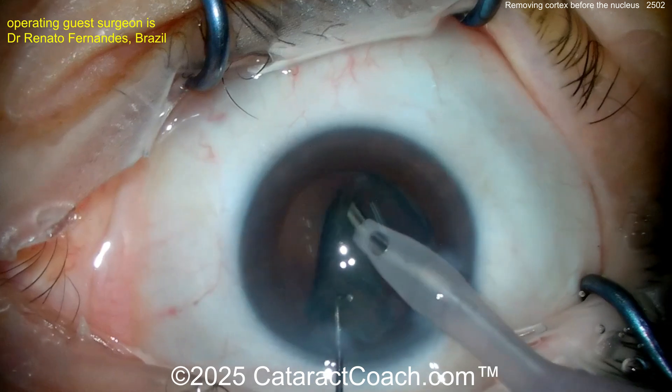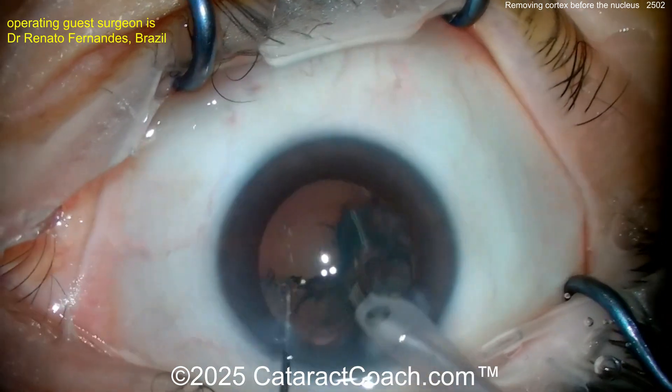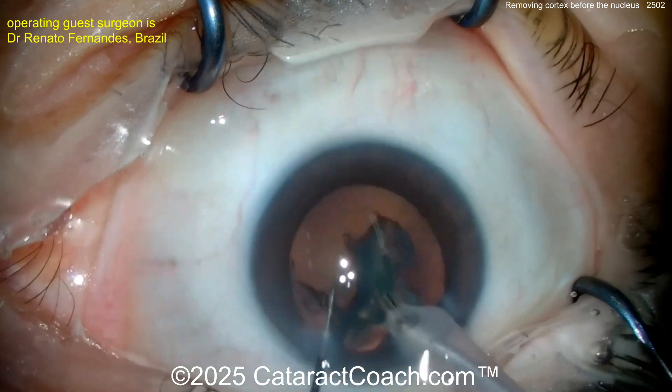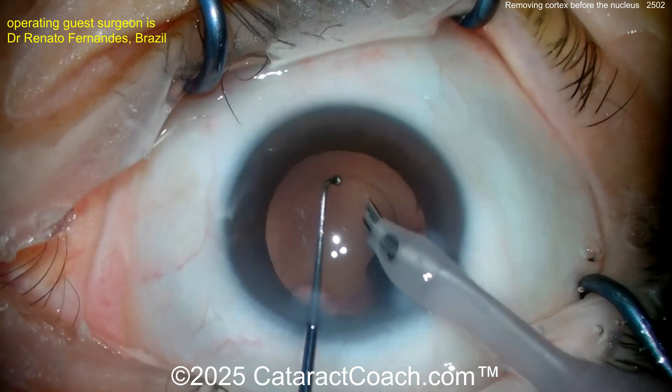Grab that epinuclear shell — there it is. Get it flipped over. My favorite technique for an epinuclear shell is to flip it over, and once it's flipped it's a lot easier to move. Nice good flip here, and aspirate that down. Look at that — the bag's empty. You got all the cortex out. That is pretty slick.